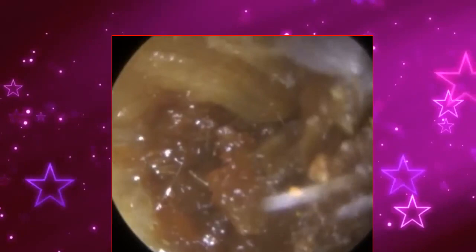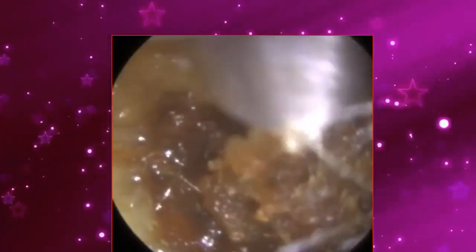Keratosis obturans, it's similar to a game of Jenga, I suspect. You pull one of the Jenga pieces and it suddenly all crumbles. So it's the same with keratosis obturans. You generally find that it's a bit of a struggle, but as soon as you remove a particular lump of dead skin or a particular strand or ribbon of dead skin, the house of cards almost falls, like the Jenga pieces will collapse, and you just remove one piece. It's the weak link of the plug of dead skin. It just makes the rest of the procedure easier to remove.